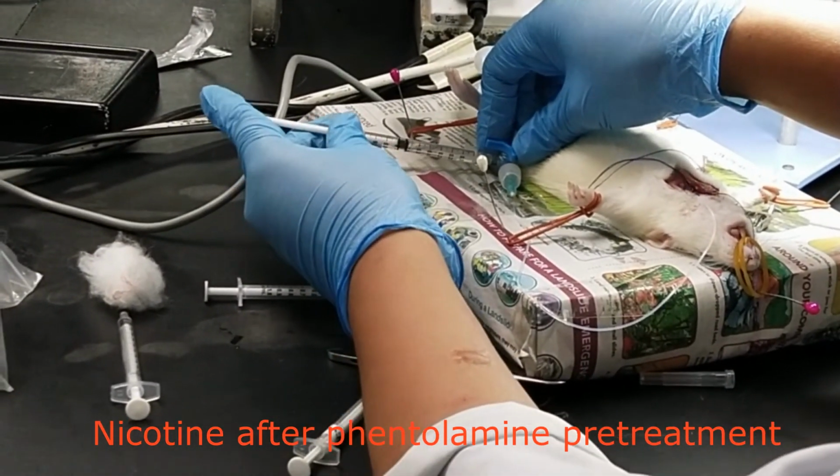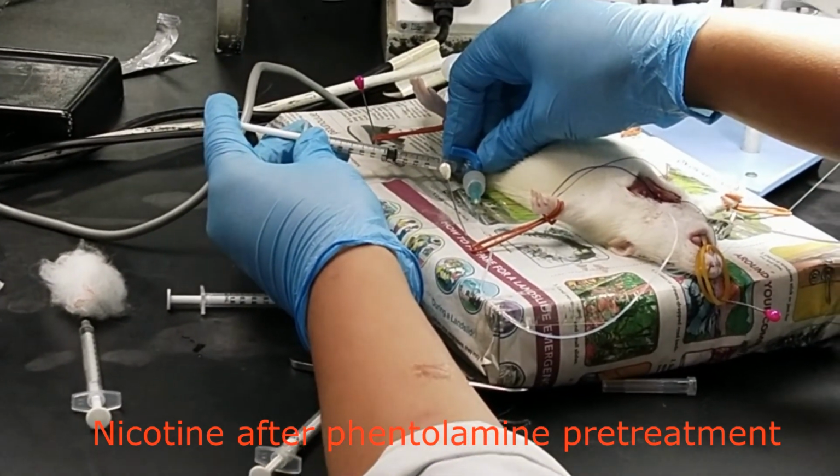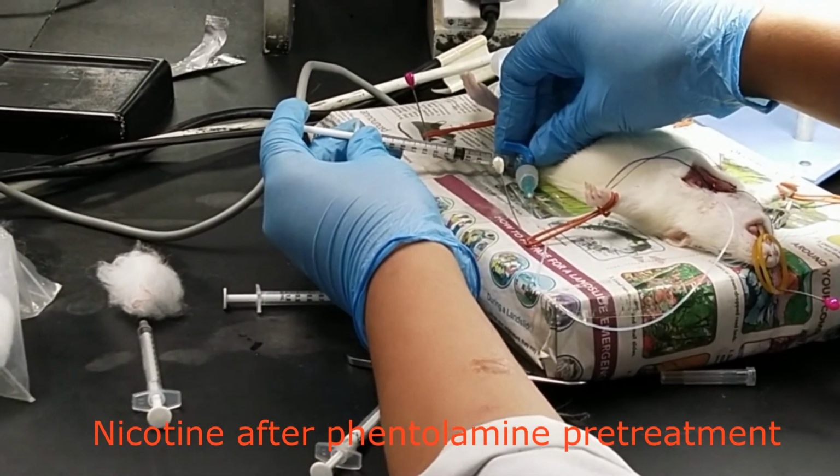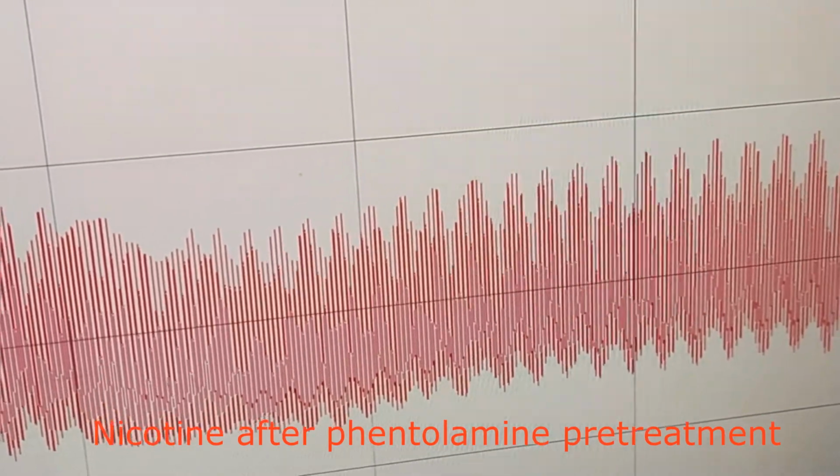Okay, so after the injection, we can see the changes in terms of blood pressure after the administration of nicotine into the system. Zoom macam tu.